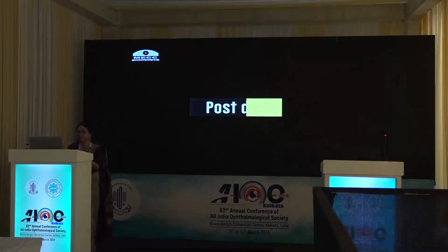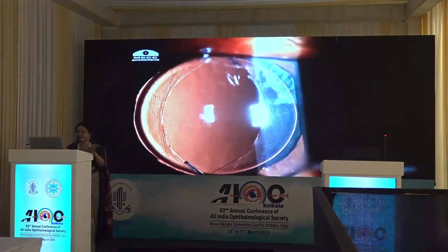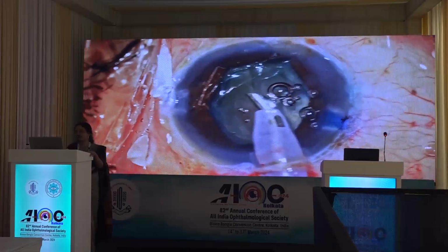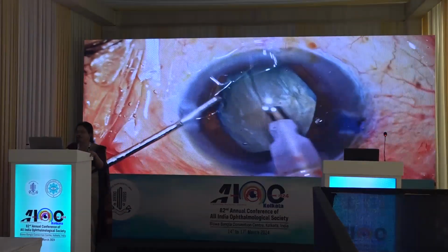In the post-op, the patient was finally doing well. Ovalization of the rhexis margin indicates optic capture.